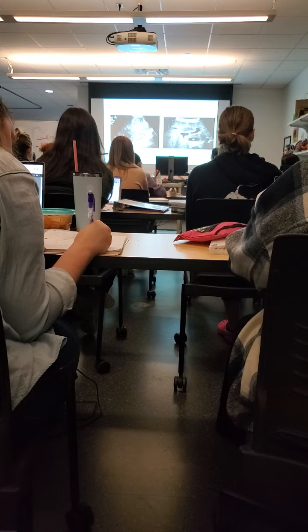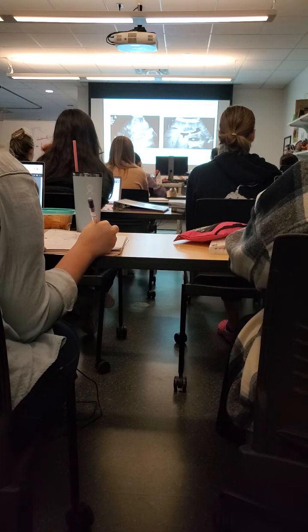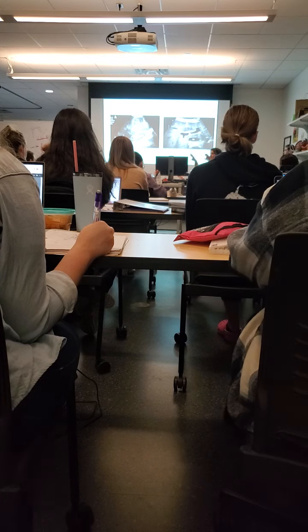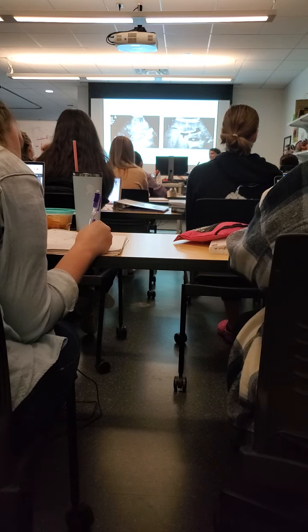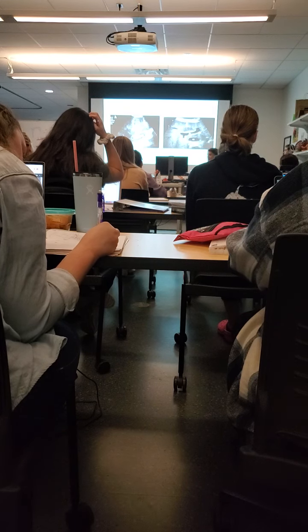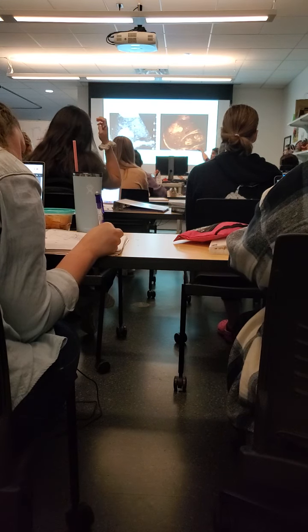I would say that there's pretty smooth borders. What about the fact that it's big? Yeah, they're not infiltrating though. They're not like little claws, right? And so that's how I decide. It's still a smooth wall, compared to that one.